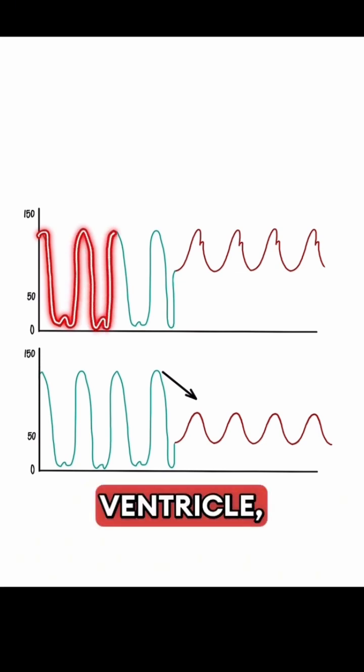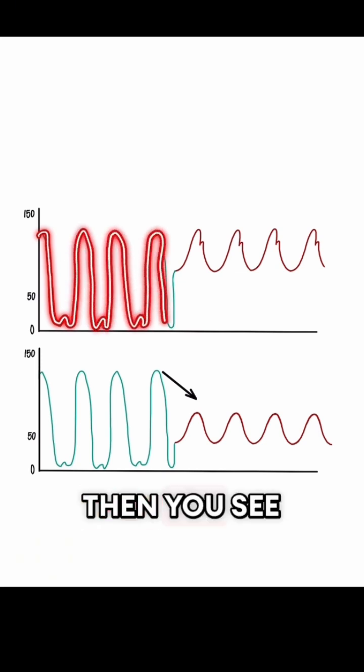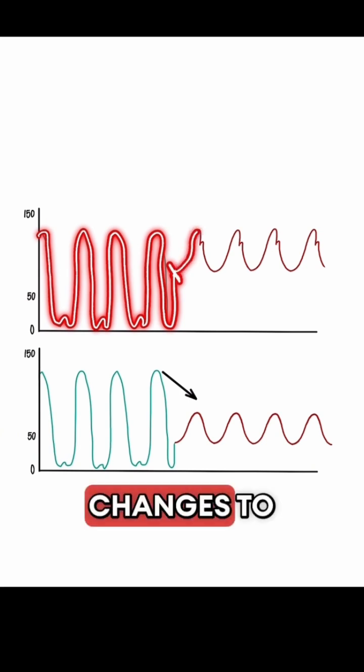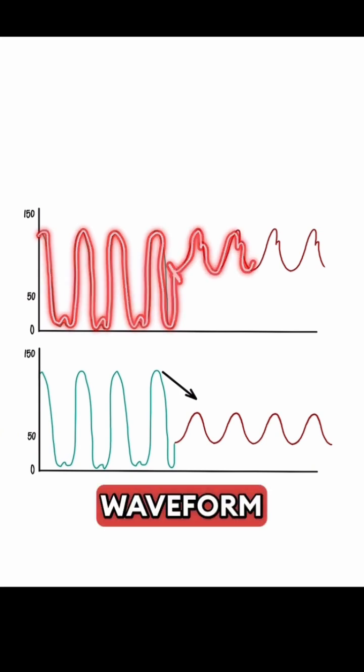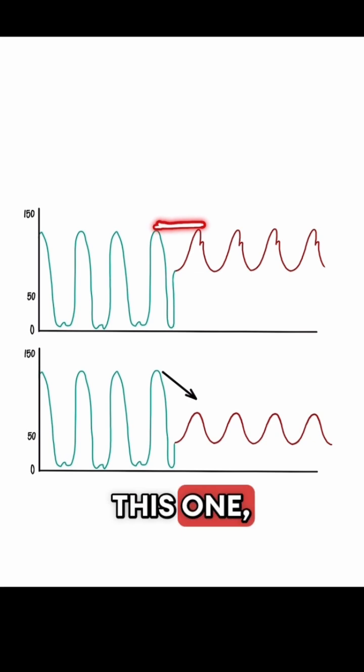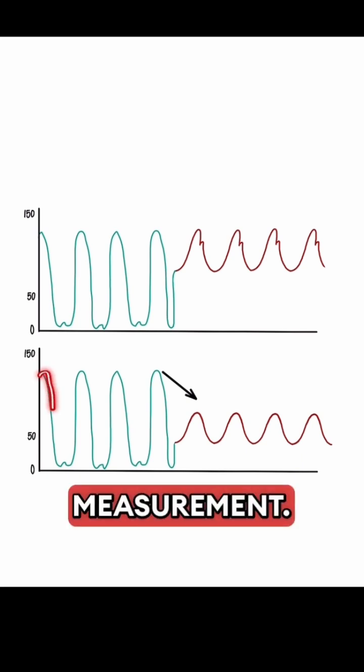So you're in the left ventricle, you record that pressure, then you pull back across the aortic valve and the pressure changes to an aortic waveform like you have here. Now this one, there is no gradient between the two, so this patient does not have aortic stenosis by waveform measurement.